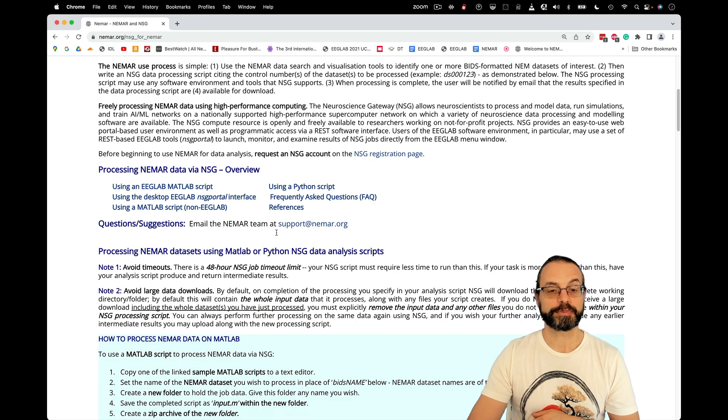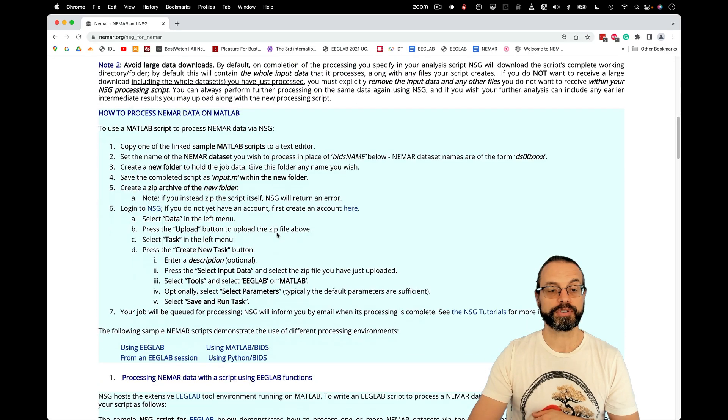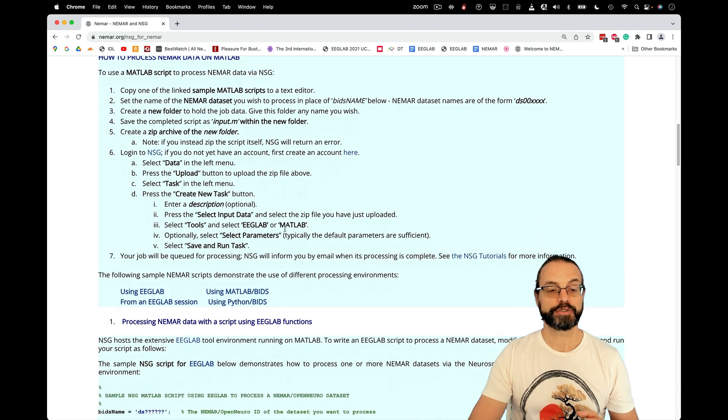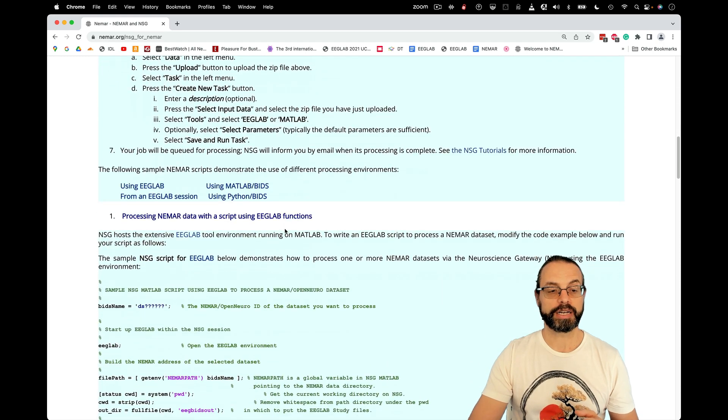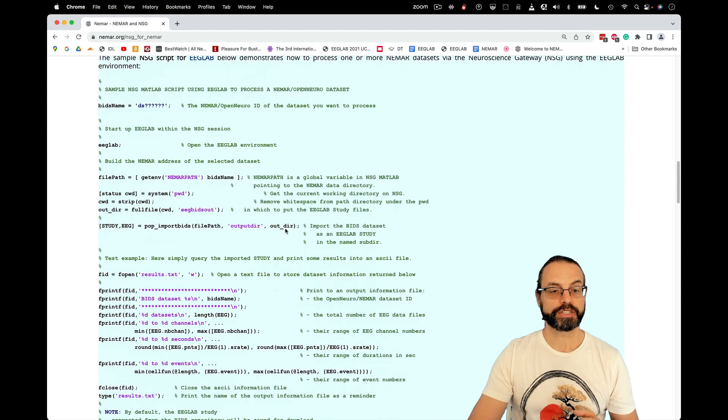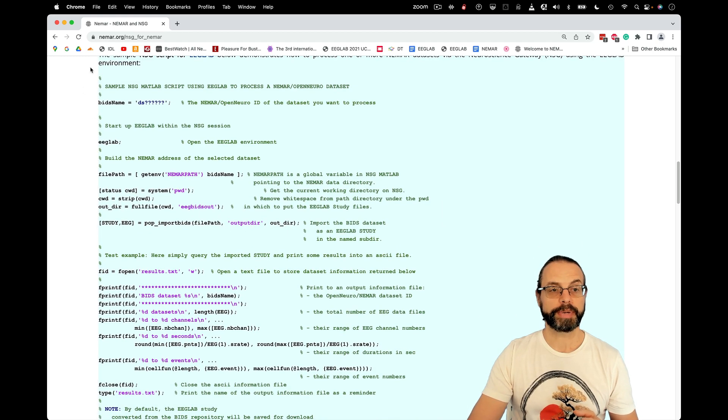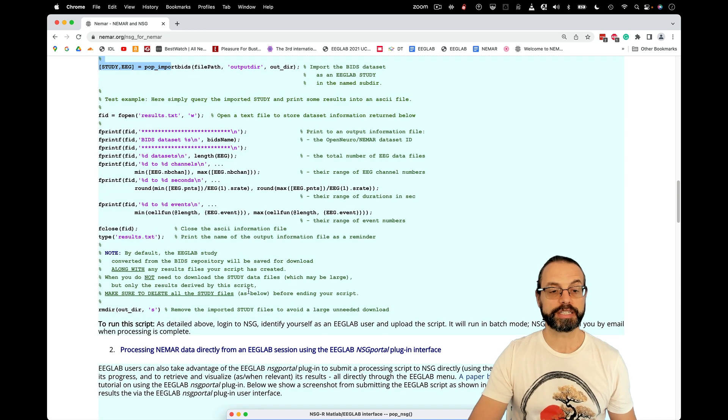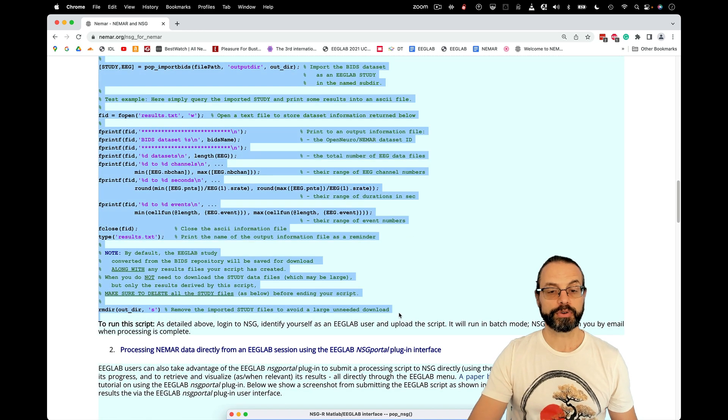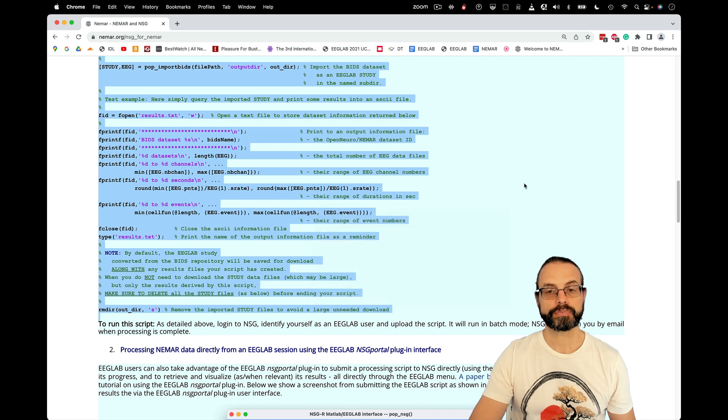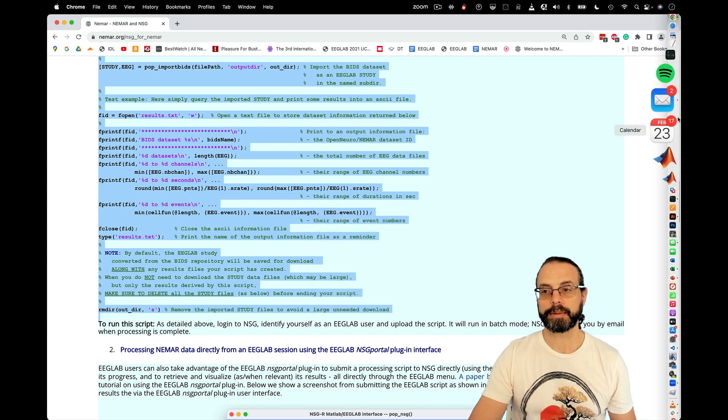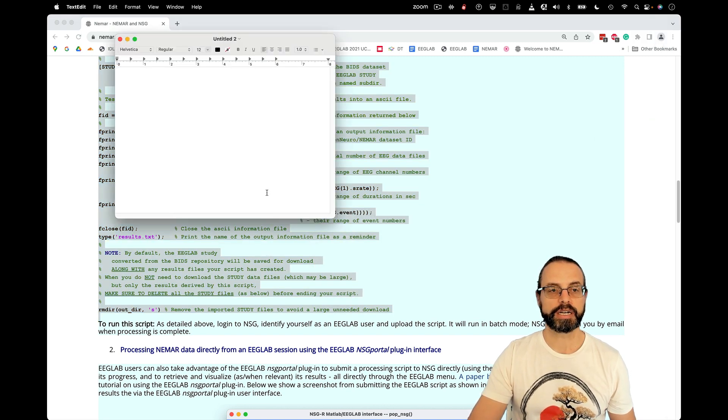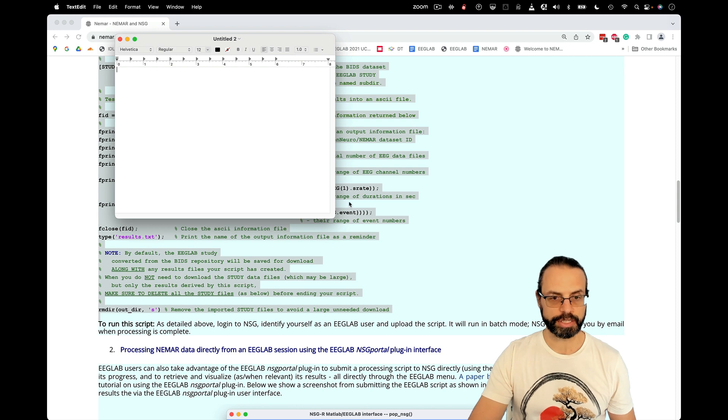There are some scripts available here. You can run MATLAB and Python scripts. Here, we're going to run a MATLAB script. Here is one of the MATLAB scripts and a tutorial of how to run it. Here, I'm just going to copy. I'm going to paste this into a new document.